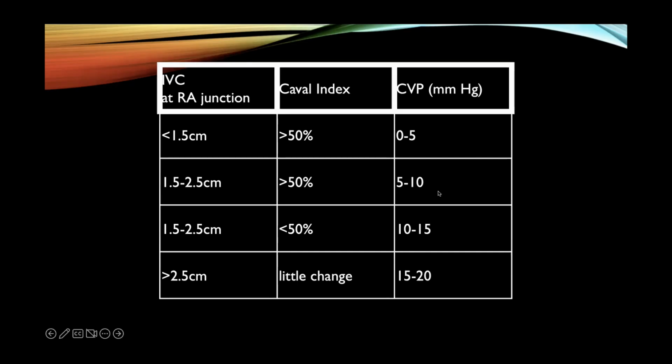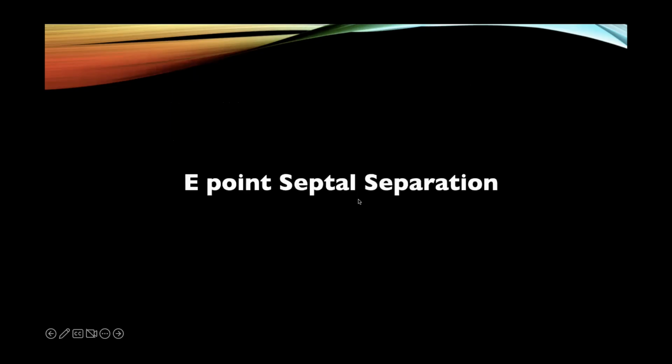Perfect. So you can use this when you're trying to make your differential diagnosis and figure out what the patient has. They don't come in saying, hey, I have a PE, right? So we have to put all these little pieces of the puzzle together to figure it out. And this is one tool you have that can help you with that. Great job.